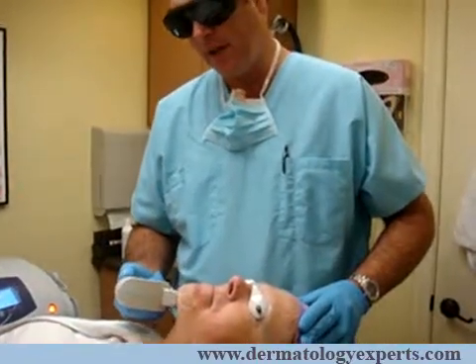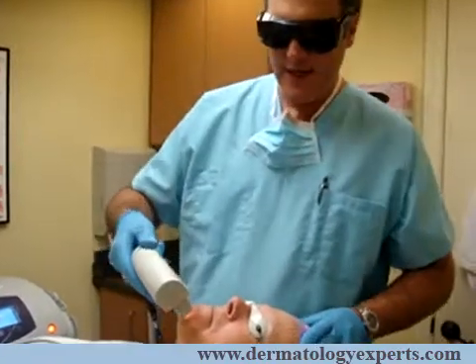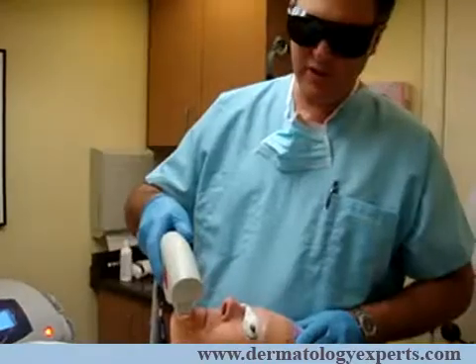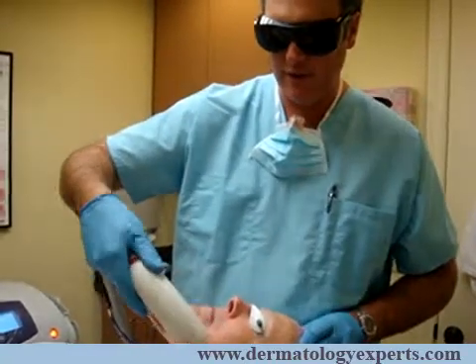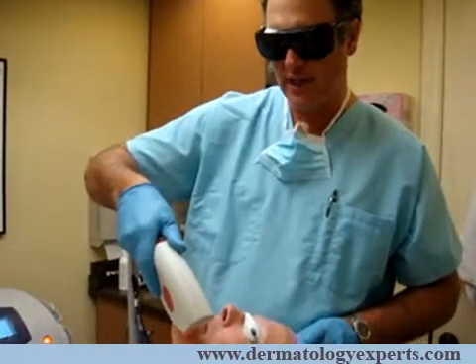This moves pretty quickly. The particular unit that I'm using, the Harmony unit, has a spot size of almost two inches by an inch. The utility and beauty of this is that you can treat large areas very quickly — it's one of the few devices that has this large spot size.